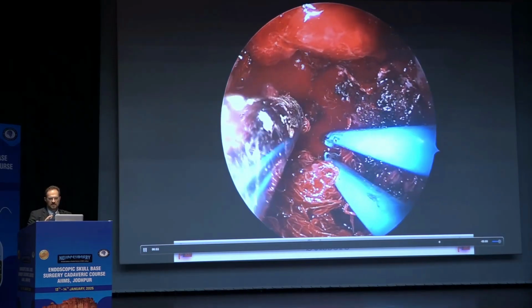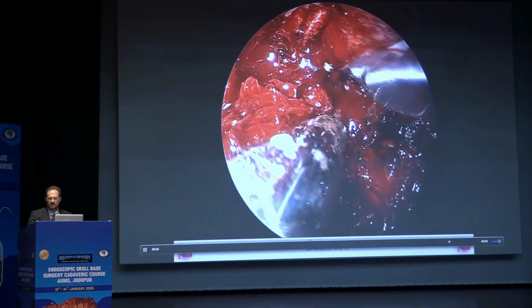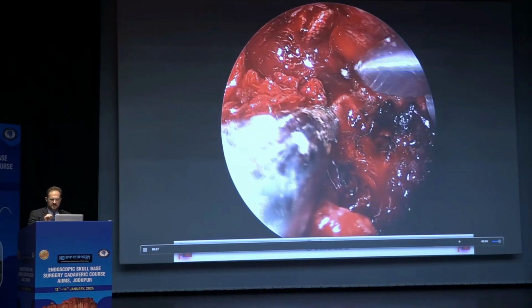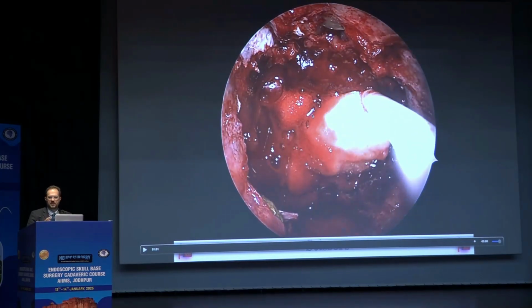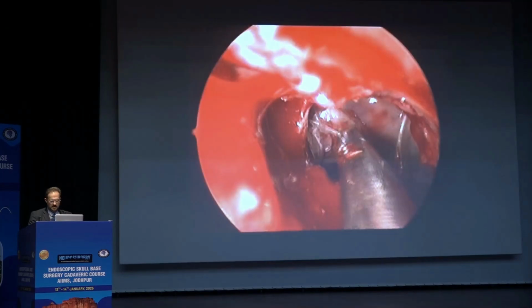I think every time you try to bipolar, you make the hole bigger. If it is a little branch, perhaps. We talked about FloSeal today for venous bleeding, but never inject FloSeal into an arterial segment. The patient will never wake up, because it's going to embolize the entire arterial system. So don't put it inside. But the use of compression and the use of muscle is very helpful.